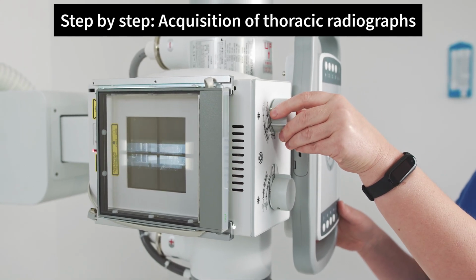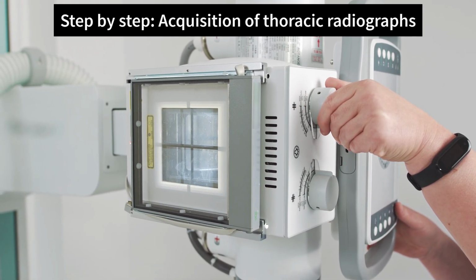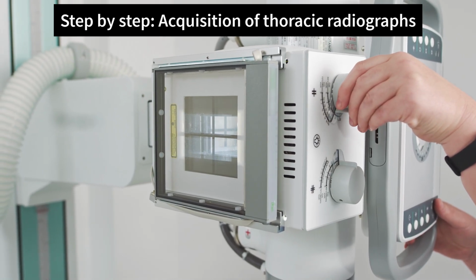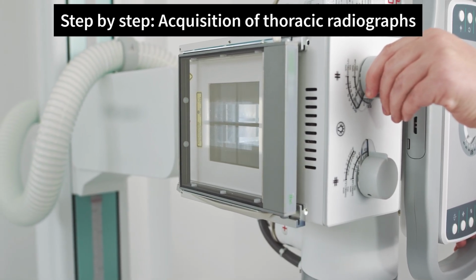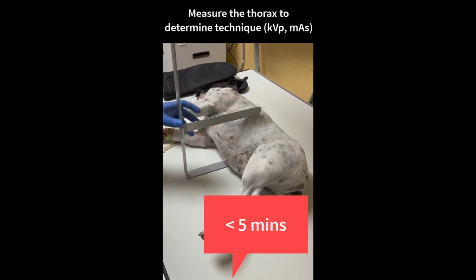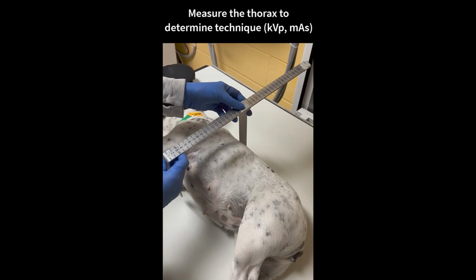This is a step-by-step instructional video on how to obtain thoracic radiographs, including some important considerations for positioning. These principles demonstrated in a canine patient are also relevant for many other mammalian species. Initially start by measuring the width and height of the thorax. This helps to determine your radiographic exposure factors.